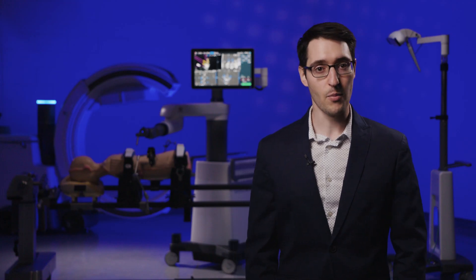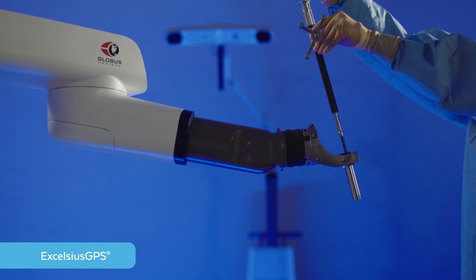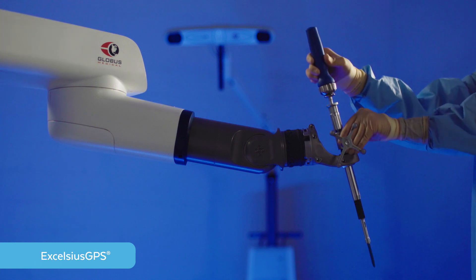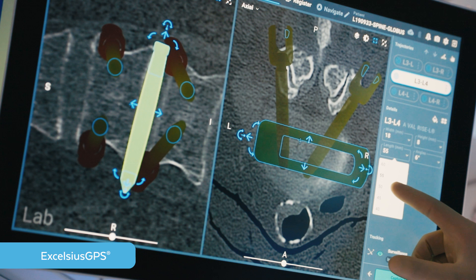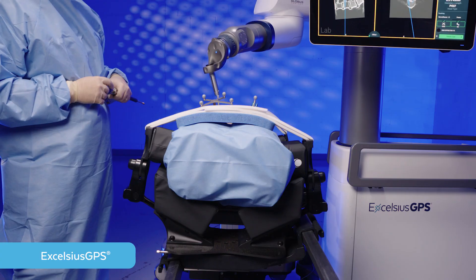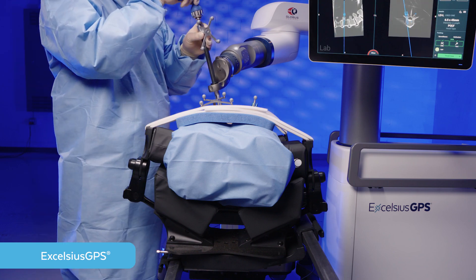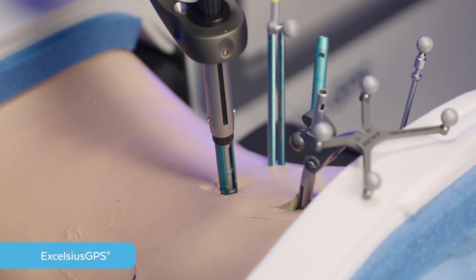The second key component of the Excelsius Prone Lateral Surgical Solution is the Excelsius GPS robotic navigation platform. Excelsius GPS is designed to streamline surgical workflow, reduce radiation exposure, improve OR efficiencies, and reduce the surgeon's cognitive load. Regardless of patient positioning, Excelsius GPS improves accuracy of screw placement in MIS surgery compared to traditional surgery.